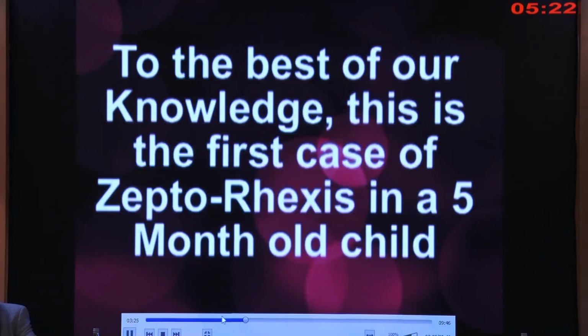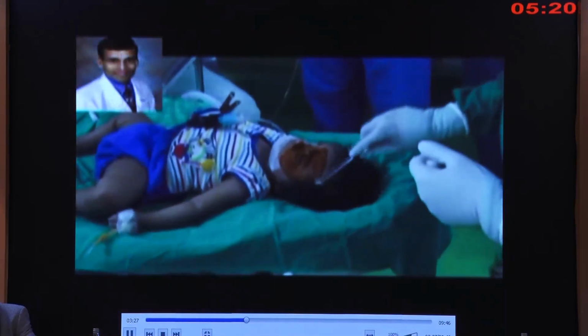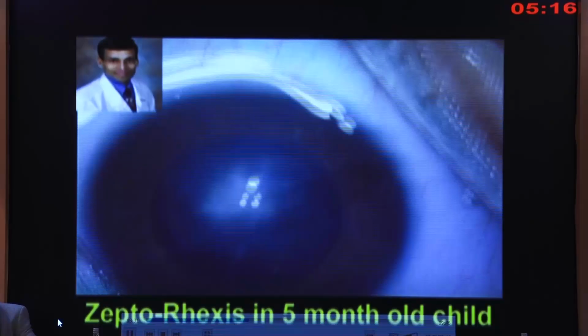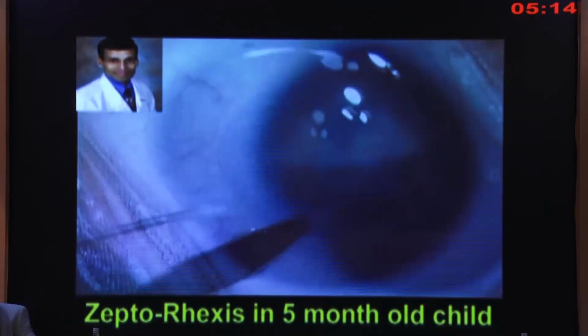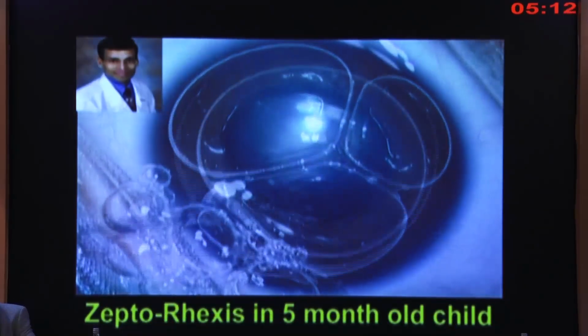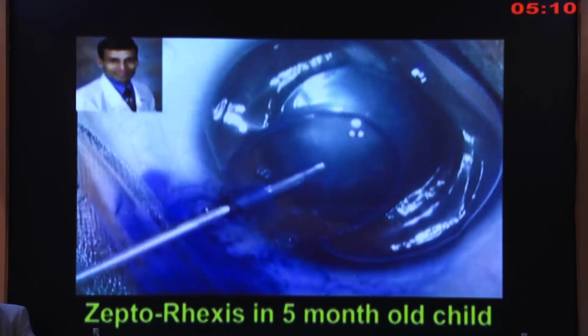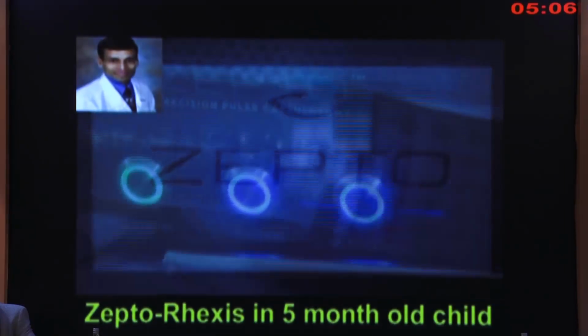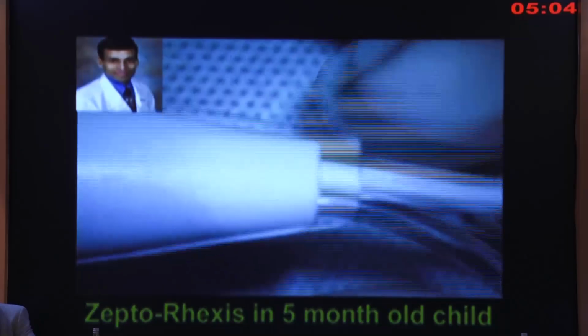nanopulse technology. And this is the first case, a 5-month-old child who came to us from Mumbai, and I have done the cataract surgery of her father also. So she's a 5-month-old child, and we have used Zepto nanopulse technology to do the rexis.